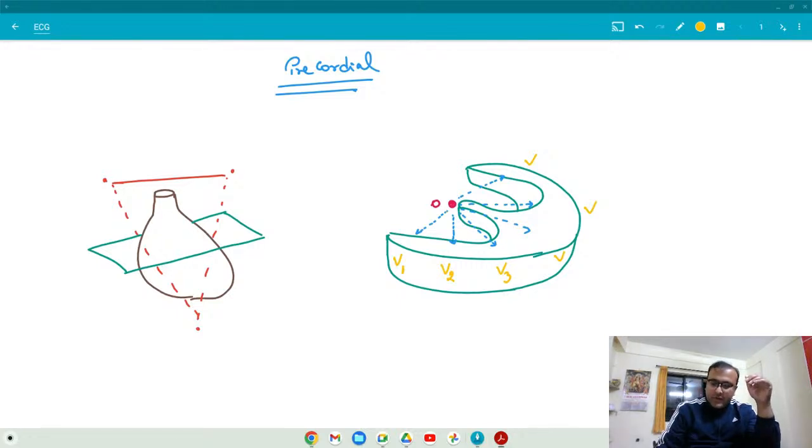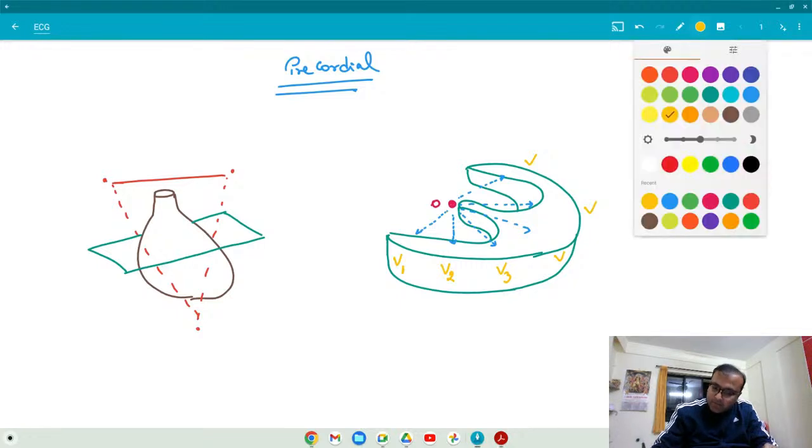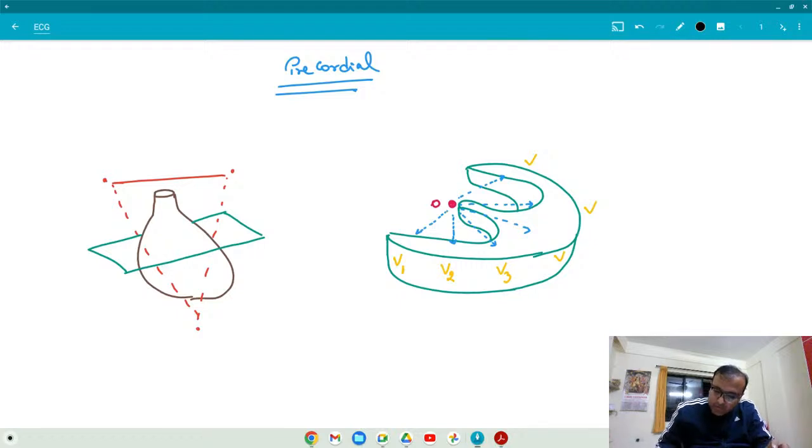Very good. Because we are thinking about the major ventricular depolarization. Okay, let me clear it out. I want to talk about the major ventricular depolarization. So let me draw the arrow also for you. This is the direction of major ventricular depolarization.